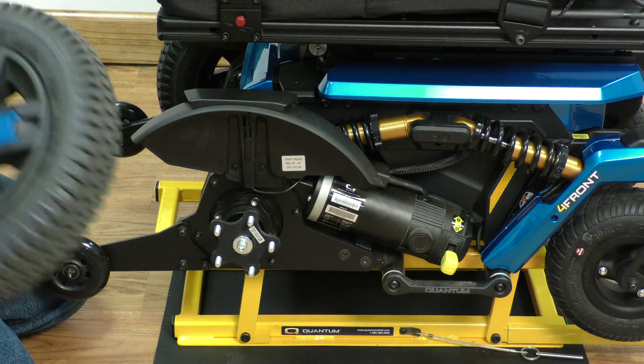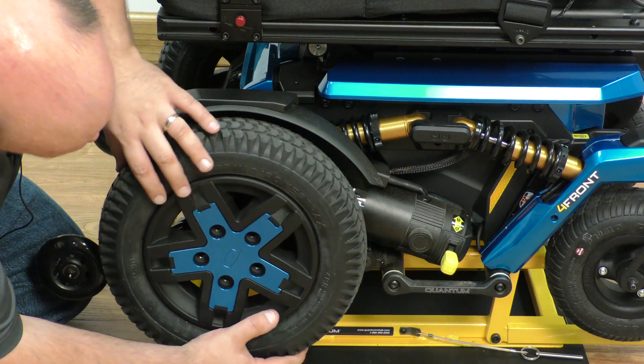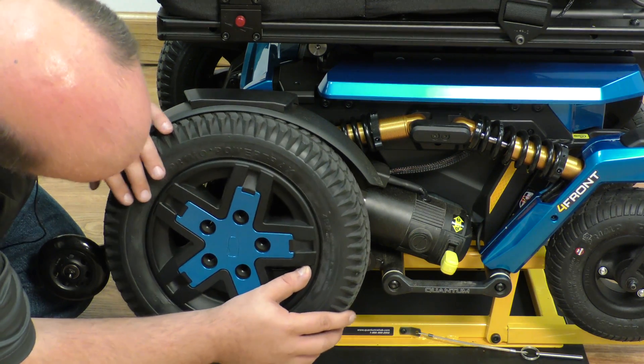And finally, we will replace our drive wheel.